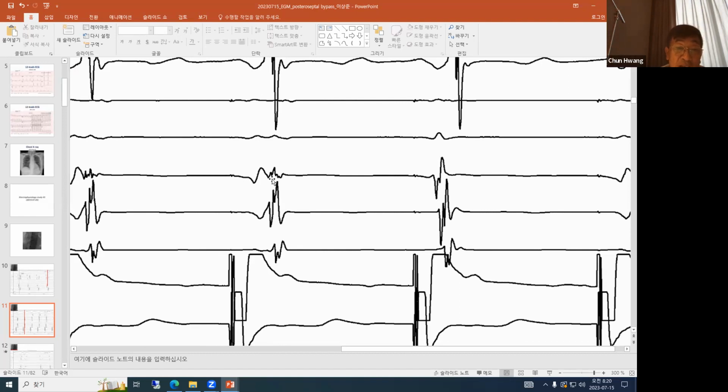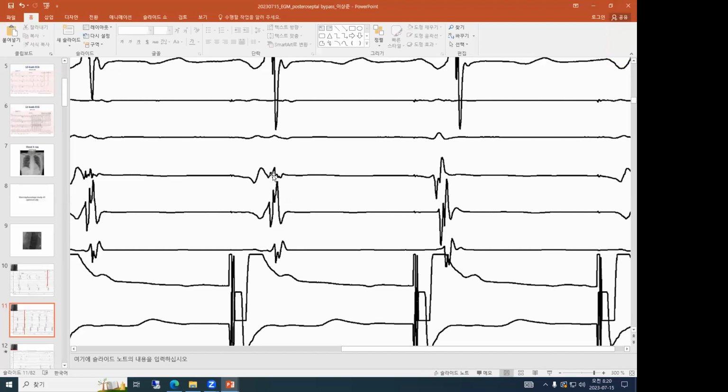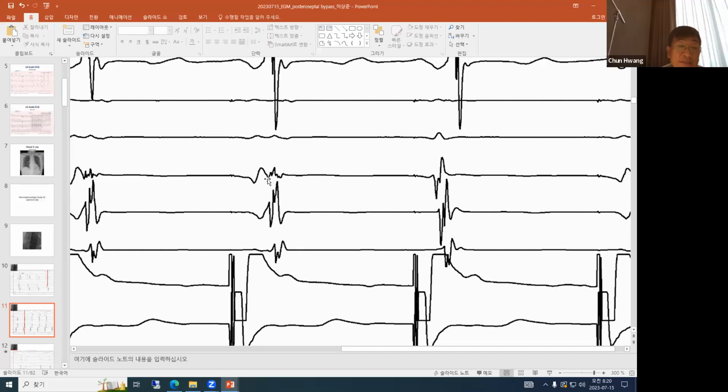If you follow down to the terminal part of the B, a small indentation appears, a little dip at the termination of the V. A little more to the left, just slightly. Yes, a little more up. Right there. Look carefully. That vector changed a little bit there, right? Which you also see in CS 3, 4. Draw the line there. Draw the cursor.